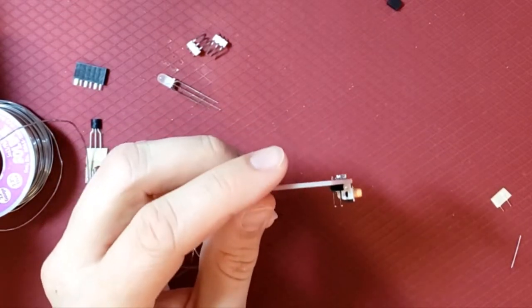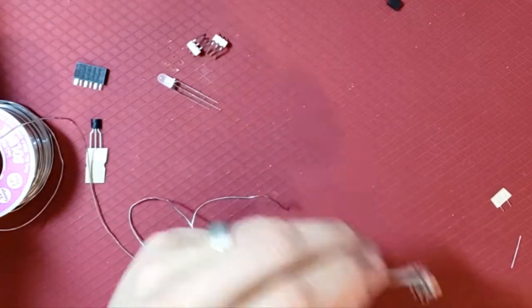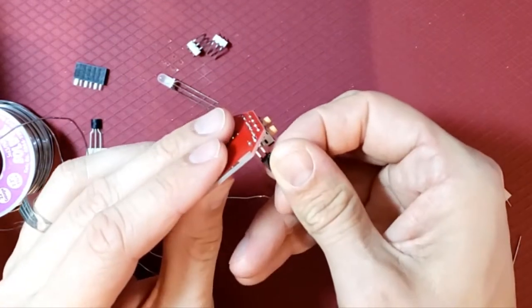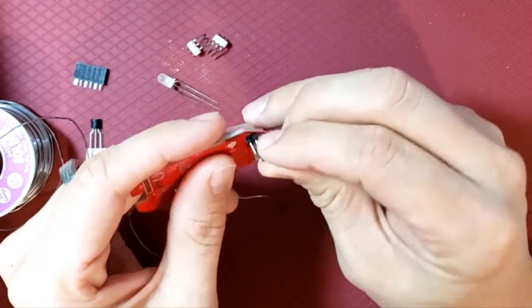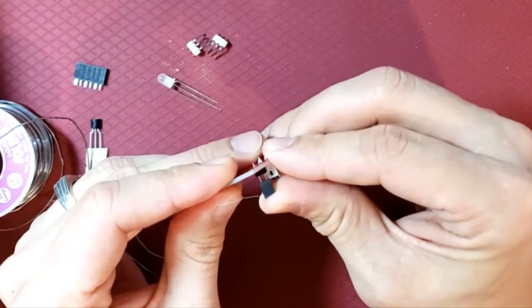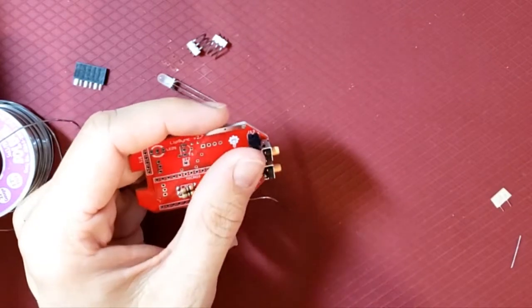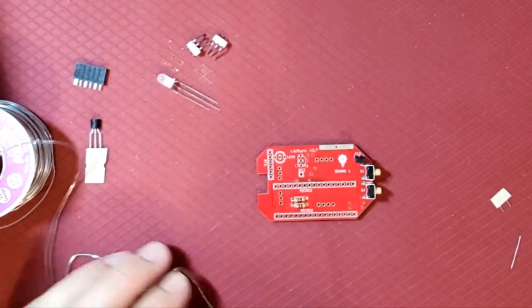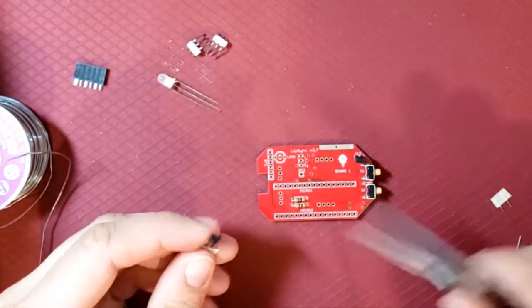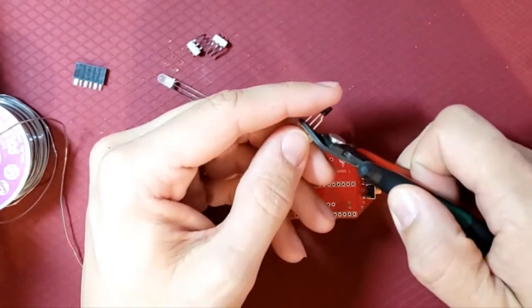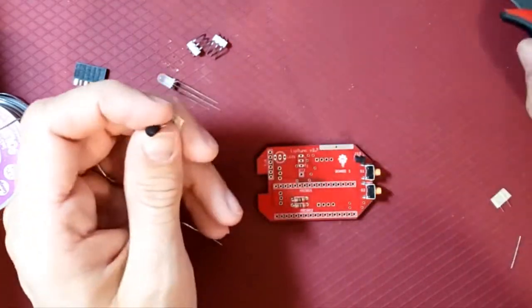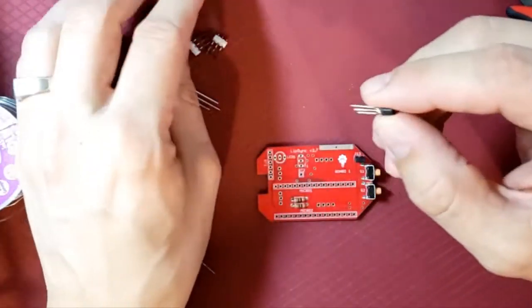These little header pins help us configure the Bluetooth mode. I'll put this little piece on here. I think I'm going to build the Bluetooth version today, so I'll end up taking this off later, but I'll follow the instructions for now.